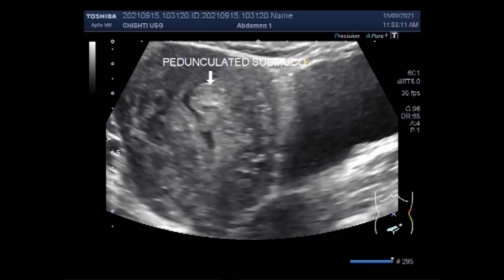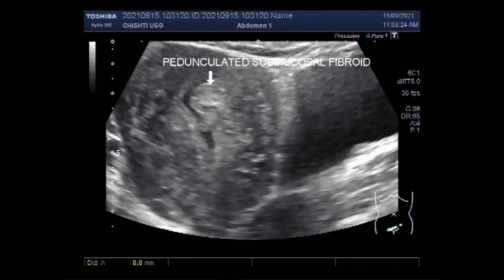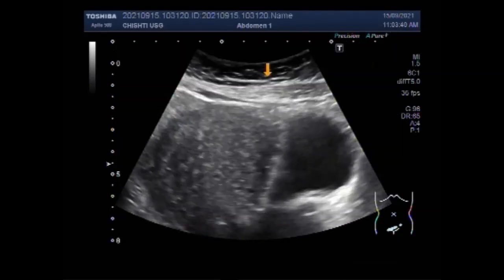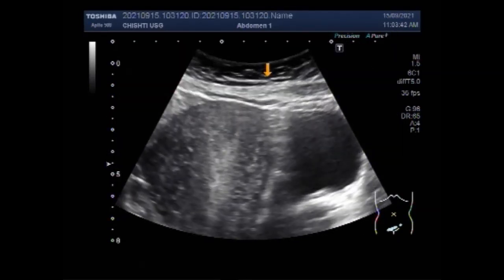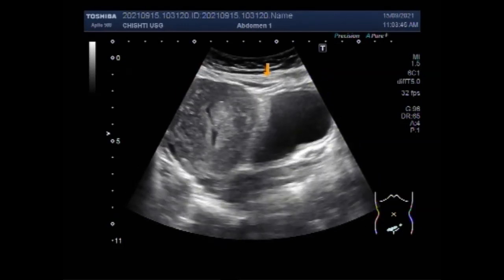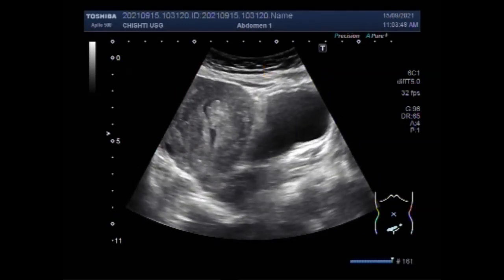Again, you can see the pedunculated fibroid inside the uterine cavity. Pedunculated fibroids are non-cancerous uterine growths attached to the uterine wall by a peduncle, a stalk-like growth. Those that grow inside the uterus are known as pedunculated submucosal fibroids, and those that develop outside the uterus are known as subserosal pedunculated fibroids.